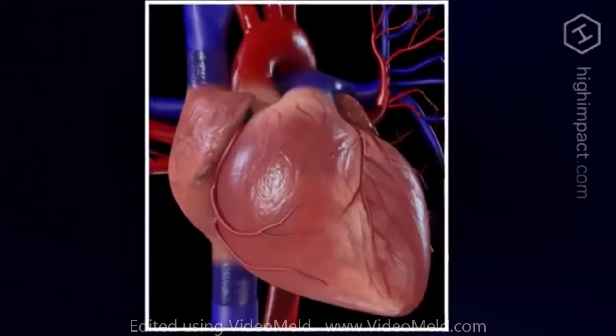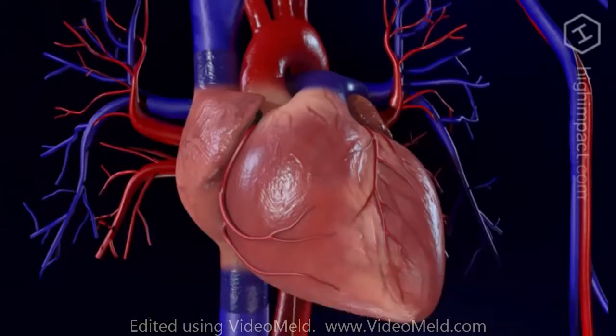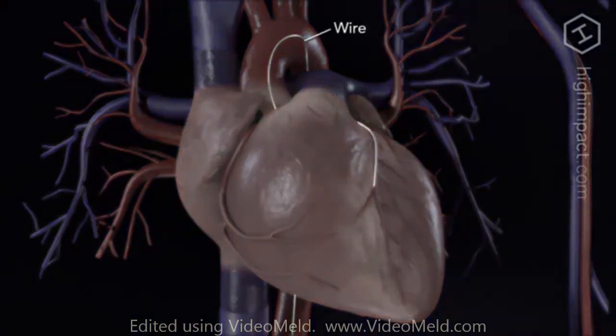Once the blockage is identified, your doctor will insert a flexible guide wire into the artery and advance a balloon-tipped catheter over this wire and into position at the site of the blockage. Rapid inflation and deflation of the small balloon pushes the vessel wall out, re-establishing blood flow through the artery.